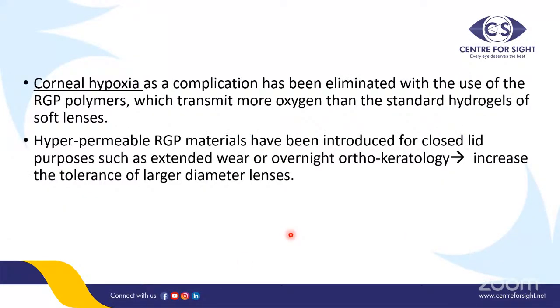So corneal hypoxia was initially a huge problem because the transmission of oxygen through previous materials like PMMA, glass or standard hydrogels was difficult.